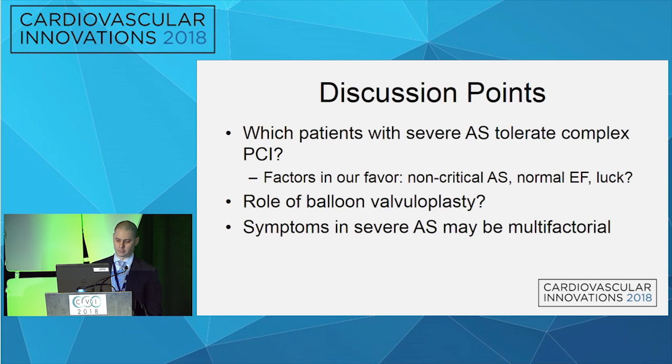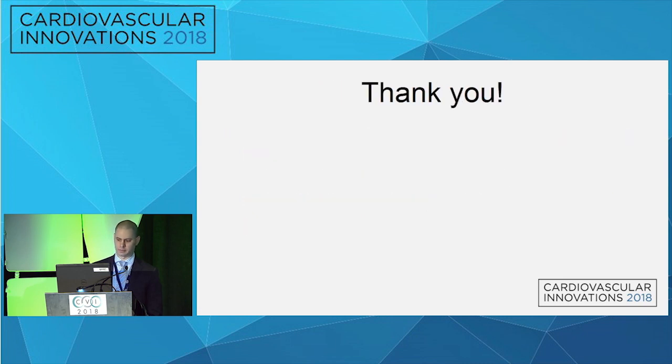There may be a role for balloon valvuloplasty. We got away with not doing it, but maybe especially if you're closer to critical AS, it's a good idea. And one thing we showed here too is that symptoms in AS are going to be multifactorial, and sometimes coronary disease might be contributing a large part to the symptoms. Thanks.